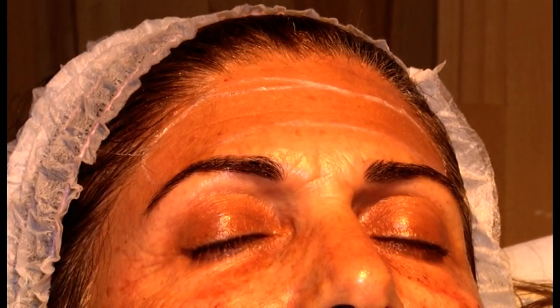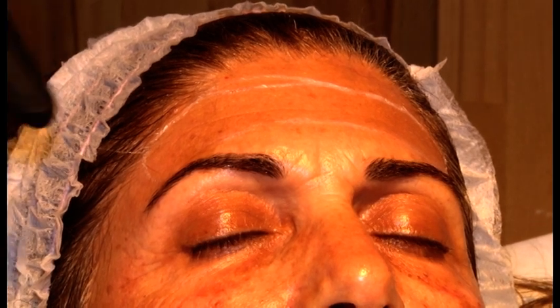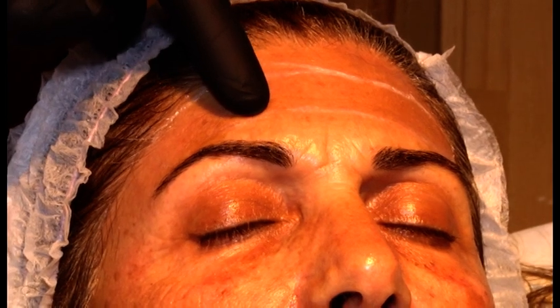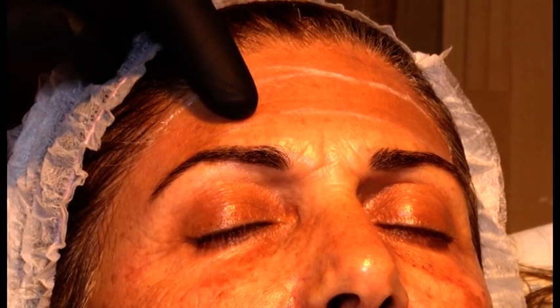Right. For the forehead, if you inject in the subgaleal space, you will understand from your patients that it's quite intimidating, because if you scrape with your cannula over the bone, the patient hears this loud noise over the bone.